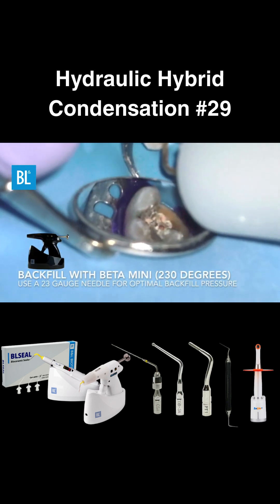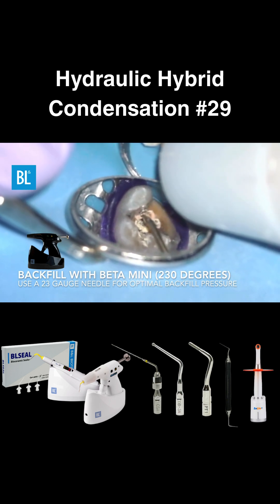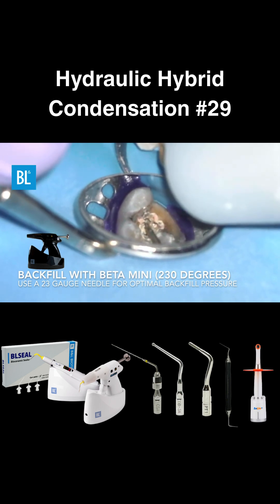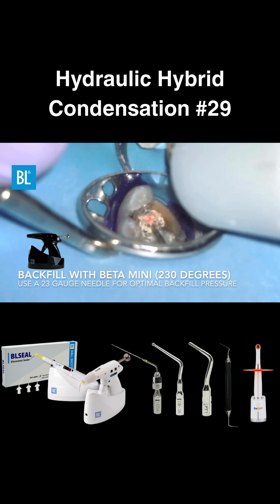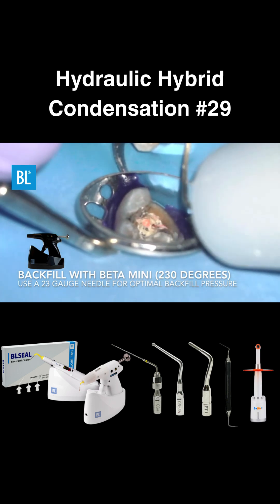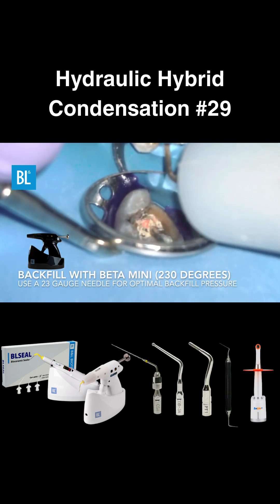For backfilling, use the Beta Mini set to 230 degrees with a standard gutta percha pellet. I recommend a 23-gauge needle for optimal pressure and control. However, if you're working in a narrower canal or want to downpack deeper, a 25-gauge needle is a great alternative.